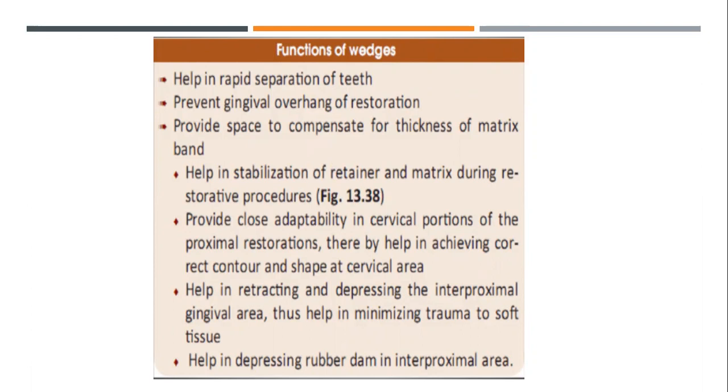They help in providing close adaptability in cervical portions of the proximal restoration, thus achieving correct contour and shape at the cervical area. Also, they can be used in retracting and depressing the interproximal gingival area, thus helping in minimizing trauma to the soft tissues. Also, they can be used in depressing the rubber dam in the interproximal area.